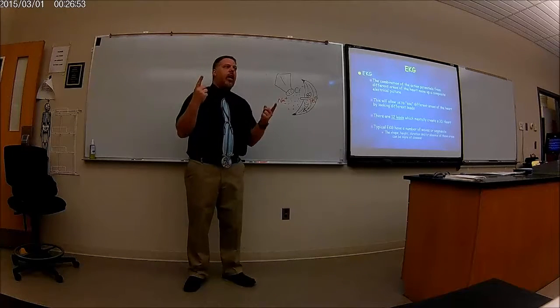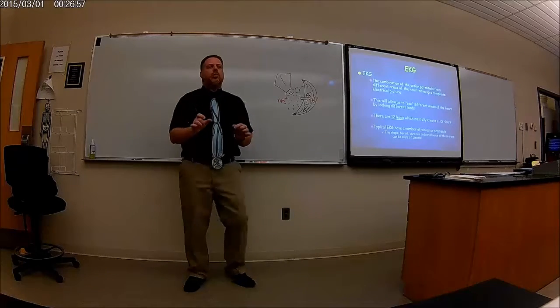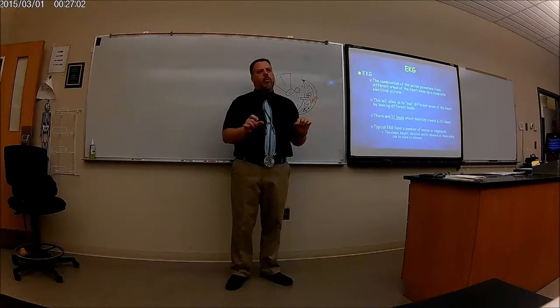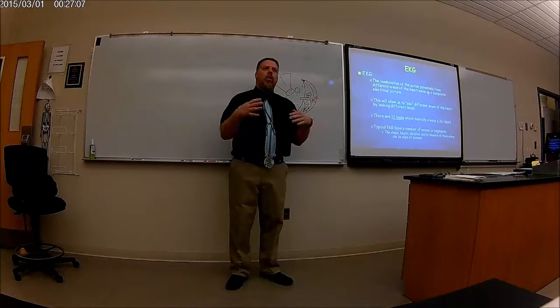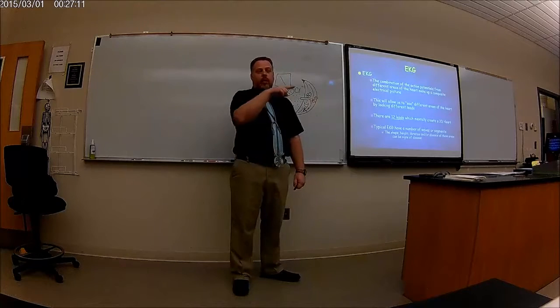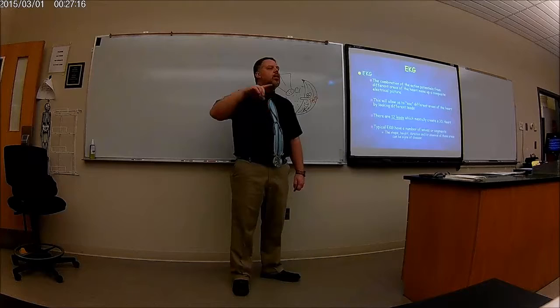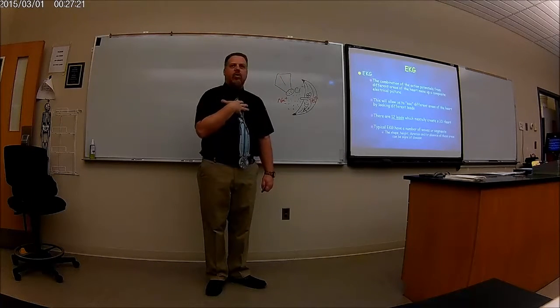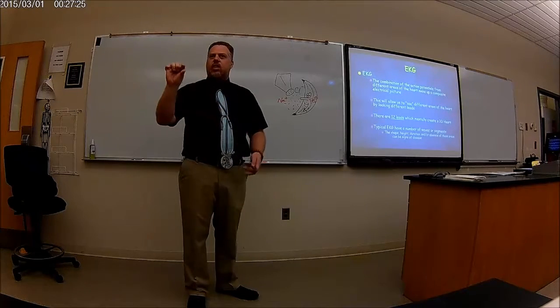And a good cardiologist will be able to look at that EKG and know what the action potential looks like in the SA node versus the Purkinje fiber. We're in no way going to be going into that. But I want you to understand what an EKG is. It's not an action potential, although you probably saw an EKG look like that. That is not an action potential. That's a conglomeration of all the different action potentials that the heart has. But now it's going to be fused into one machine, and the machine's going to spit out this EKG.